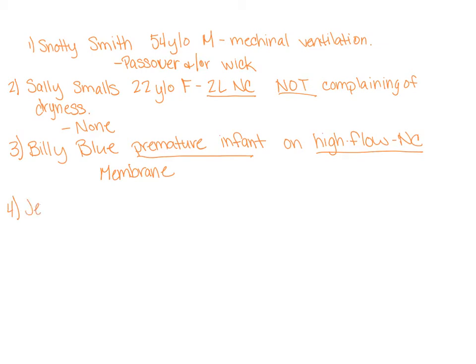Number 4, Jenny Jones is a 39-year-old female, and she's on 5 liters nasal cannula. So for Jenny, we would put her on a bubbler.